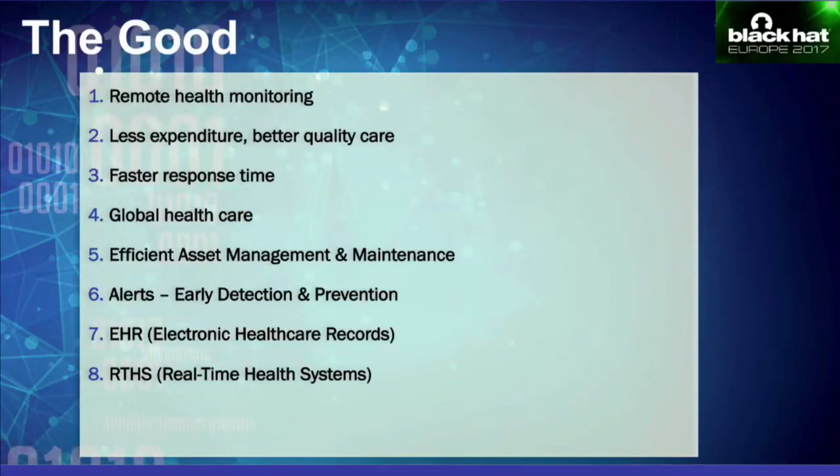EHRs are not as powerful, so they were never meant to gather data in real time. They were never meant to interact too much with the connected IoT devices. But RTHS is very powerful. It provides very powerful data analytics. Again, it takes all this real-time data, which can really be used by a lot of researchers in discerning patterns. It can be used by device manufacturers to see how the devices are functioning, and then use that data for the betterment of the device.